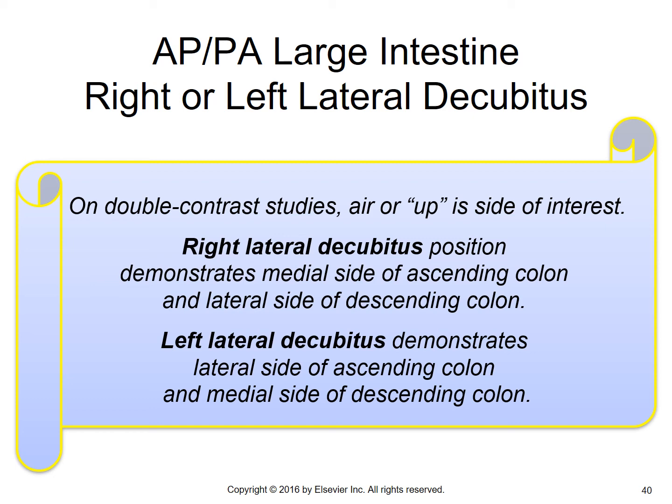These two points are very, very important for you to memorize. You often see questions on tests and review books, registry, about which decubitus is going to best demonstrate what anatomy.